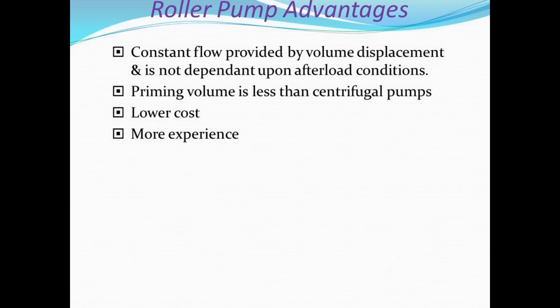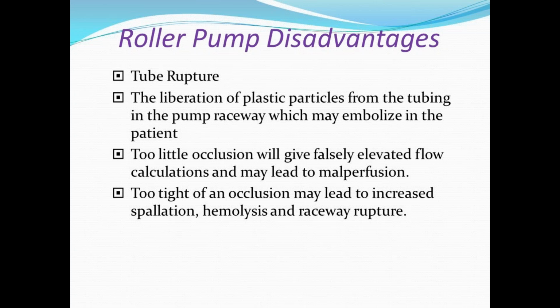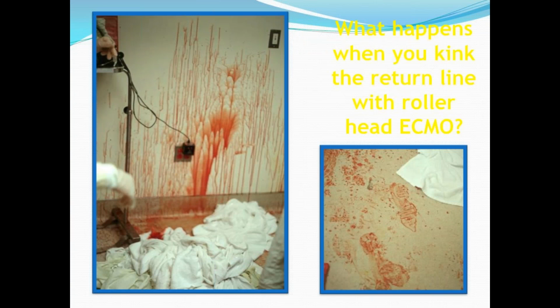This is, as I told you, rupture, degradation of plastic particles. Too little occlusion will give false elevated flow. Too tight occlusion will lead to more spallation. That is with the roller pumps.